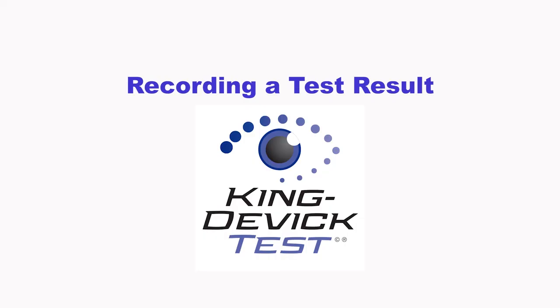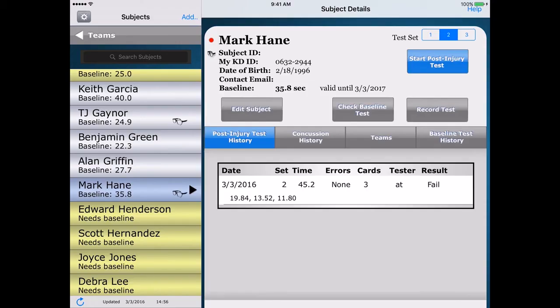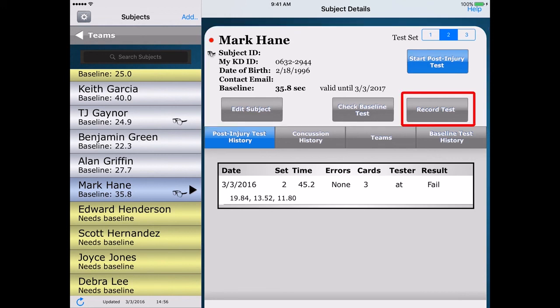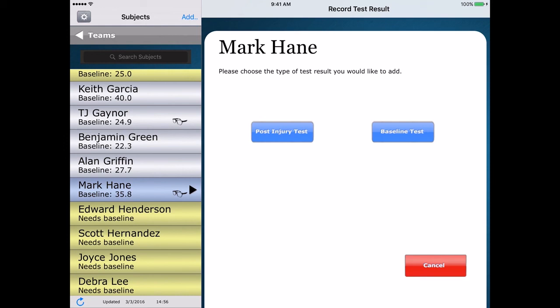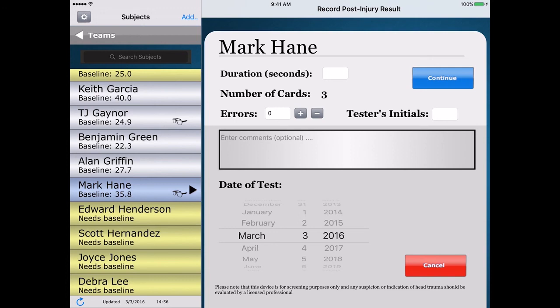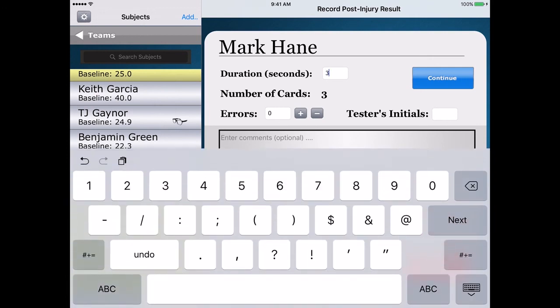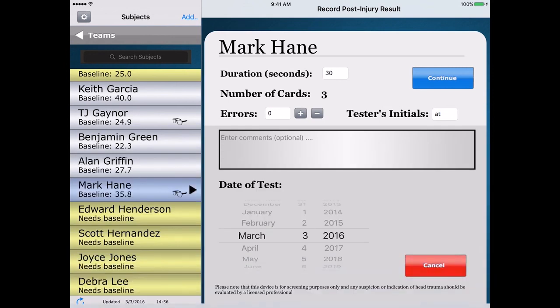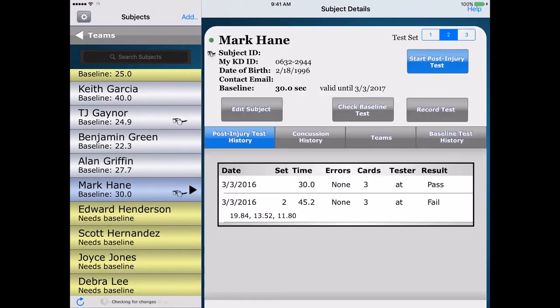The app also allows you to record prior test results in your KDTOS. If necessary, log in with your account username and password. Select the subject from the subject list on the left that you would like to record a test result for — the subject's profile will appear on the right. Tap Record Test. In the Record Test Result page, select which type of test you are recording, then enter the duration, number of errors, tester initials, any comments, and the date of the test. Tap Continue to save the result.